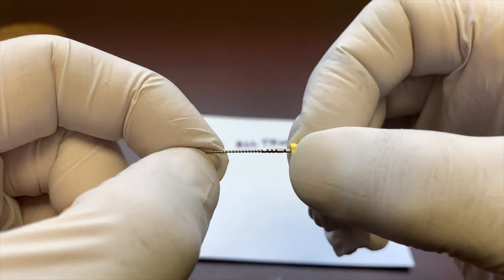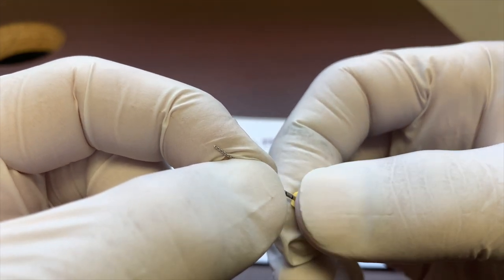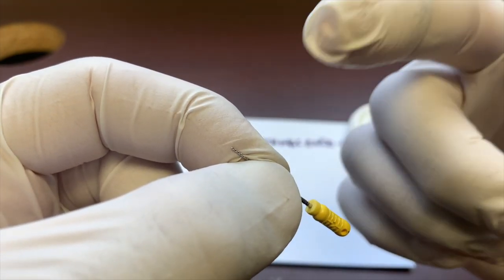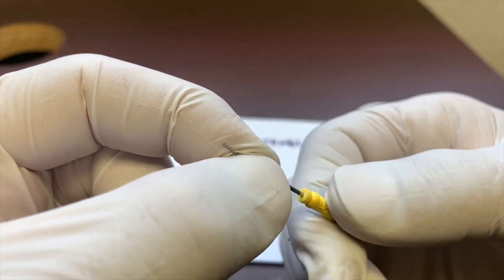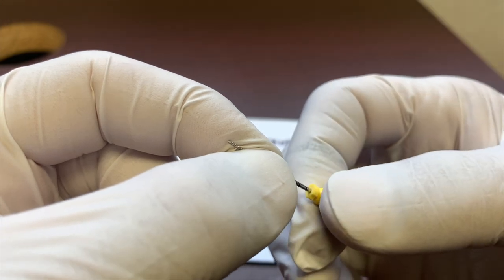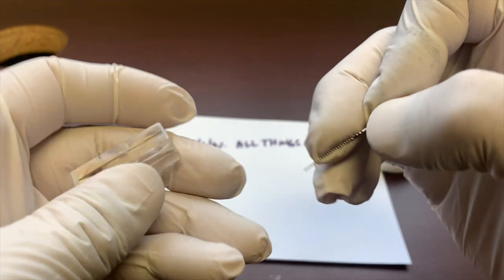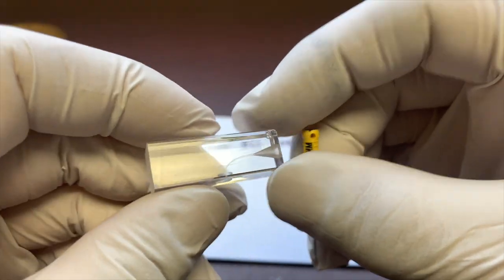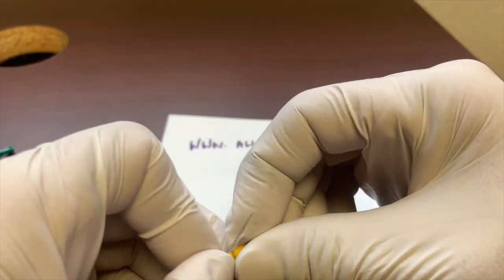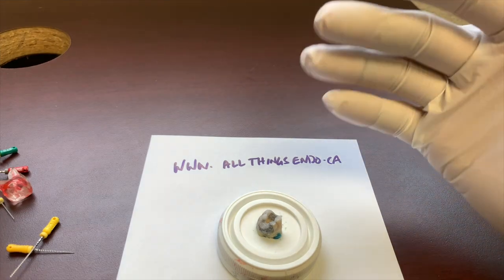So what that does is it balances the force in terms of you're still cutting. I'm cutting dentin on the quarter turn in, and then I'm engaging dentin and breaking it as I spin the file. So that's really what the intent of the balance force technique was for: curved canals with stainless steel files. Nickel titanium rotary files came out, and we've kind of gone away from that.